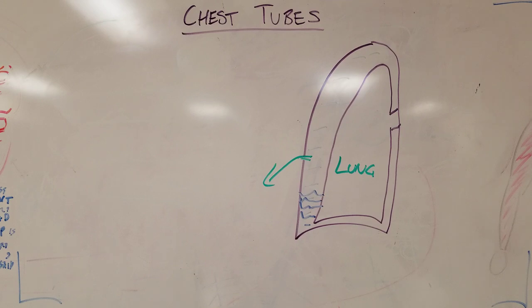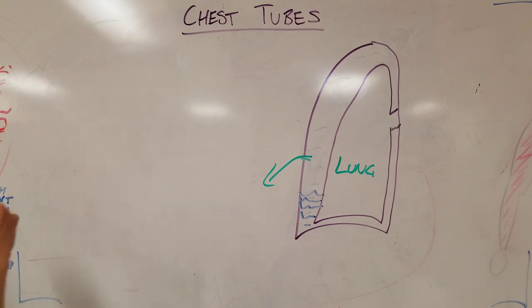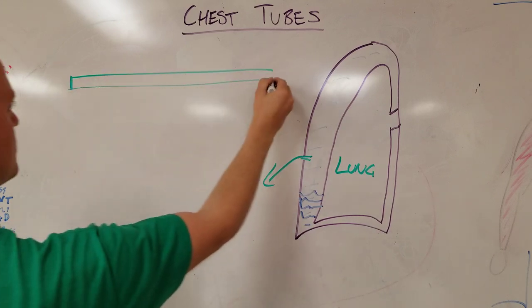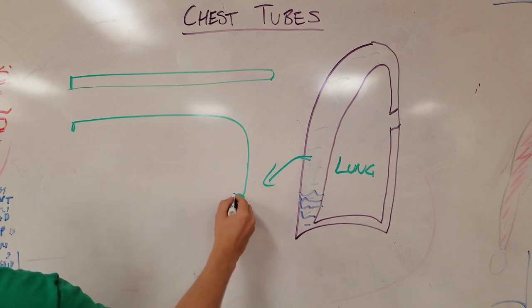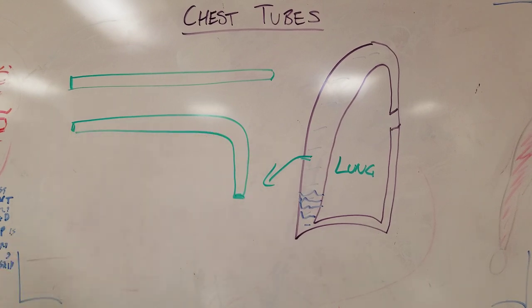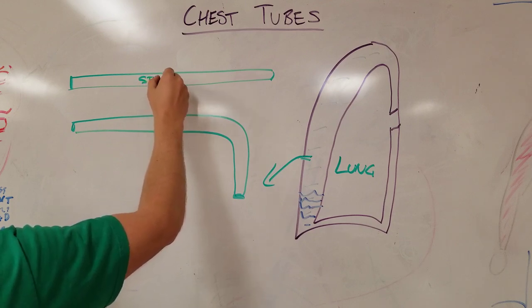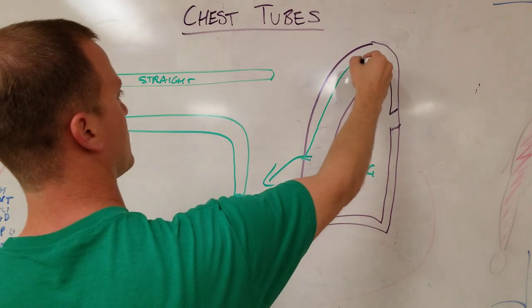Your goal then is to angle this chest tube into your desired location inside the pleural cavity. Now, they make a whole bunch of different chest tubes, but the ones most commonly seen in the trauma bay are gonna be straight chest tubes or right angle chest tubes. And they're called that because that's exactly how they look. Classically, straight chest tubes are the most common ones that you see, and these are going to be put into the apex.